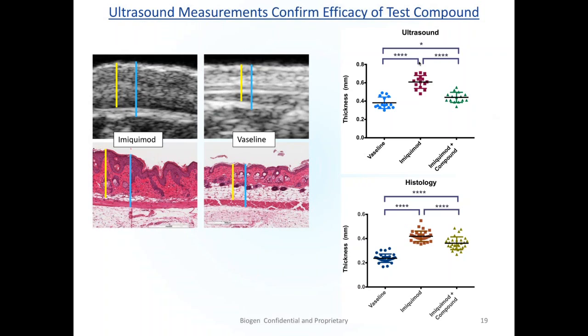We did, and it was interesting, because we first did those studies, as I said in the beginning, with the Vevo 770, and with that we couldn't see anything when we did the clippers. With the 2100, we got decent images, but we really did get better images with the Nair hair removal, so we included that. We actually have a very obsessively detailed protocol for hair removal.